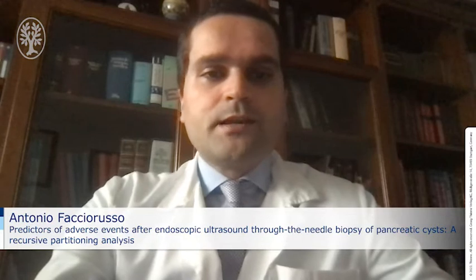Today I will present our recent study just published in Endoscopy, Predictors of Adverse Events after Endoscopic Ultrasound through-the-Needle Biopsy of Pancreatic Cysts, a recursive partitioning analysis. Preoperative accurate assessment of pancreatic cystic lesions is of paramount importance for adequate patient management. Simple morphological characterization is not sufficient to define the exact diagnosis and stratify risk of malignancy.